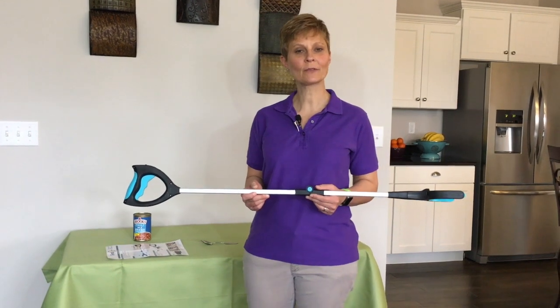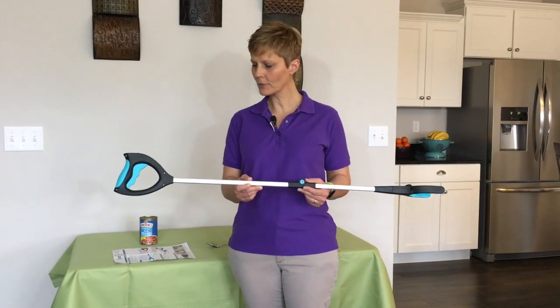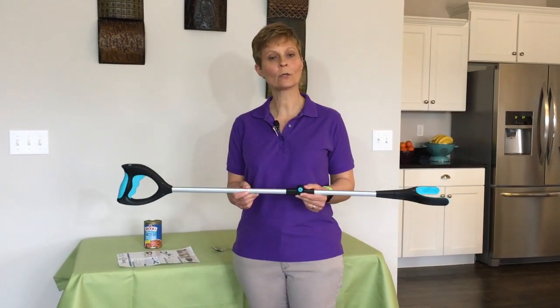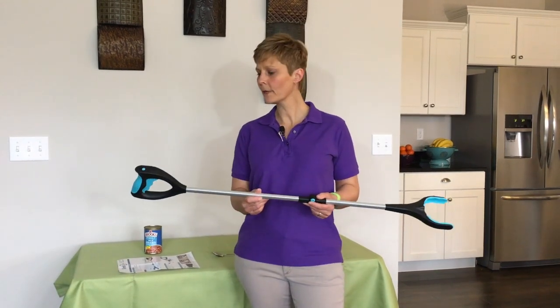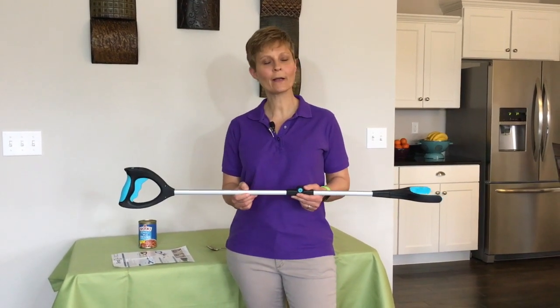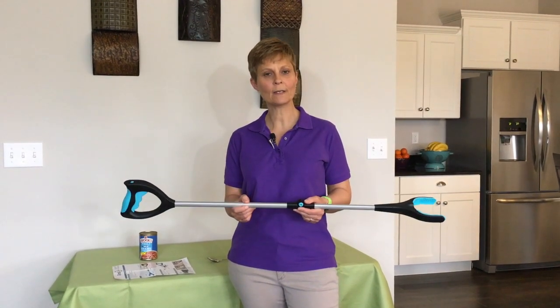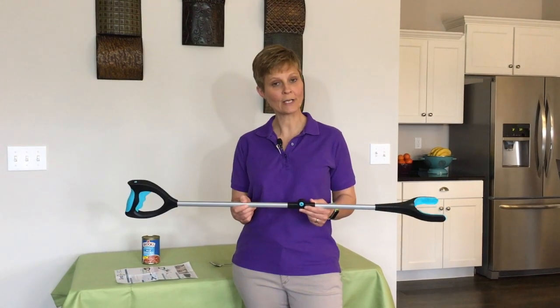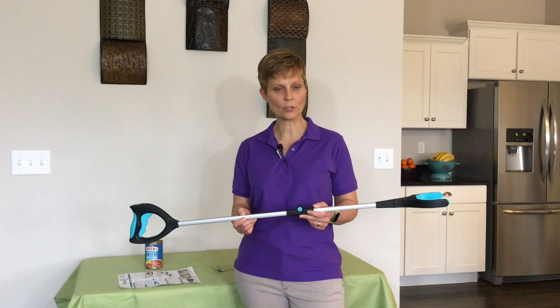Cindy here, Physical Therapist with Adaptive Equipment Corner. Today we are going to do a review video on the reacher that I have in my hands here. The brand name of this reacher is called GrabIt. Now I know we've done some videos on reachers before, but this one happened to catch my eye. I was watching and saw it on TV, so I thought I would purchase it and see what types of features it had and if they actually work like they were advertised.